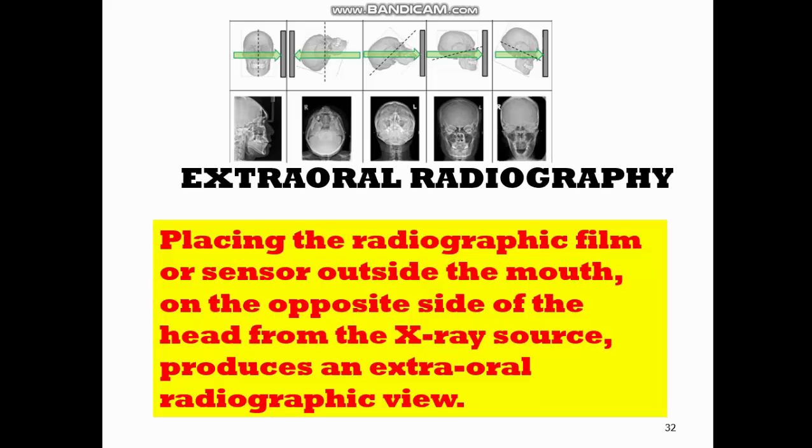Remember that we have 4 types of intraoral radiography: periapical view, bite-wing view, occlusal view, and full mouth series.